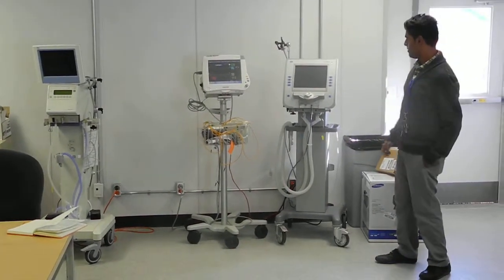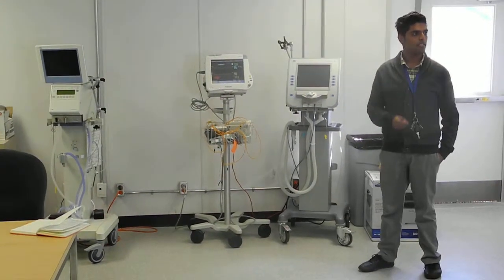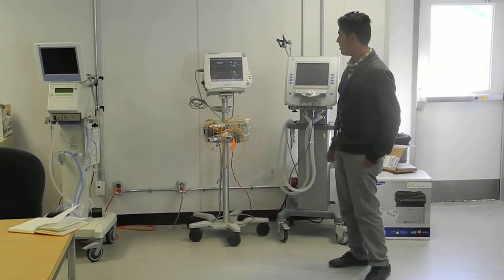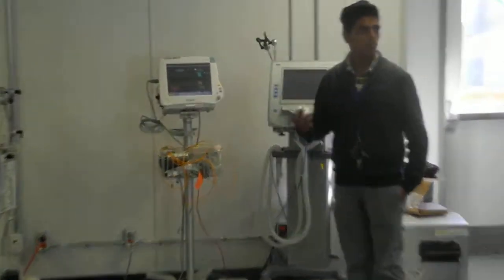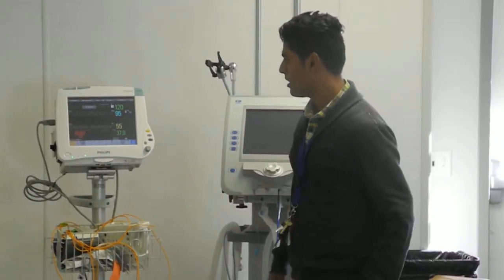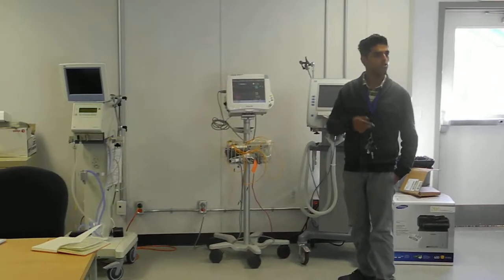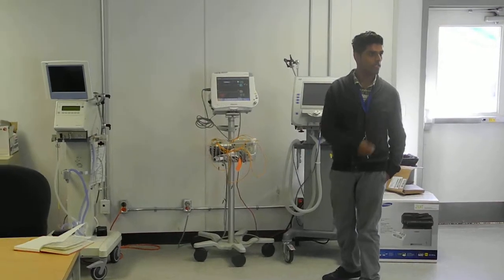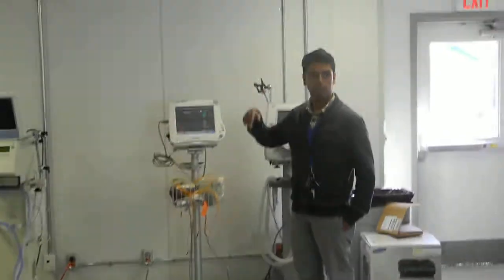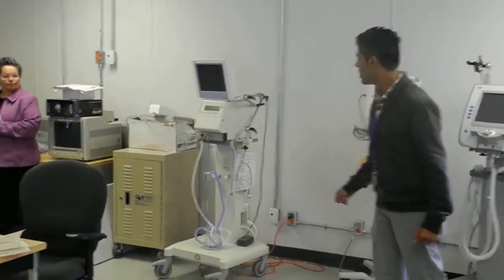We have the ventilation units, which provide some of the manual or the automatic and manual ventilations for the babies. We have patient monitors where a lot of the cardiorespiratory physiological signals are monitored. This is pretty much exactly the same line of patient monitors that we use at the Hospital for Sick Children that the neonatal intensive care unit uses. Except this is just one level higher. The MP70, we use the MP50. And that's another baby log ventilator.